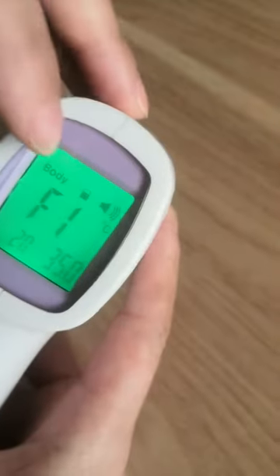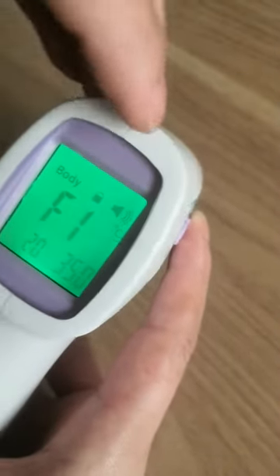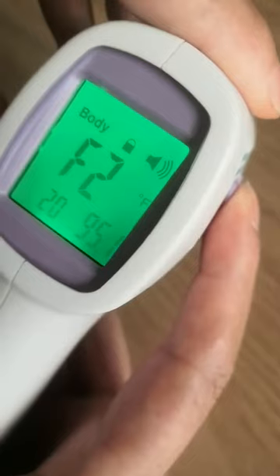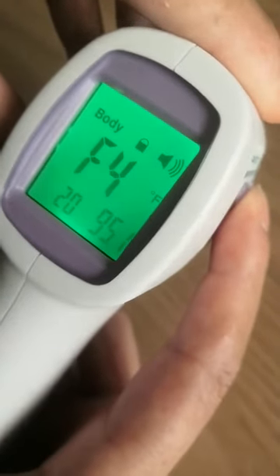You can see it will change from C to F. Here is the F. Then press the mode again to go through F2, F3, F4. Okay, now it's in this mode.